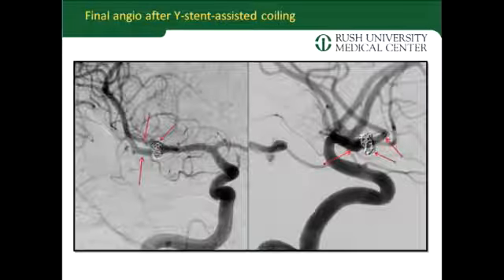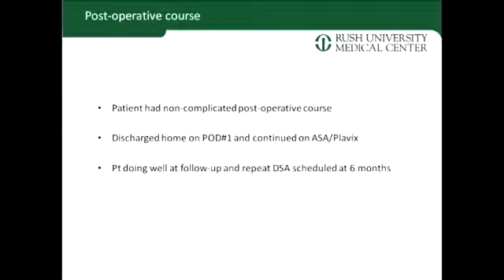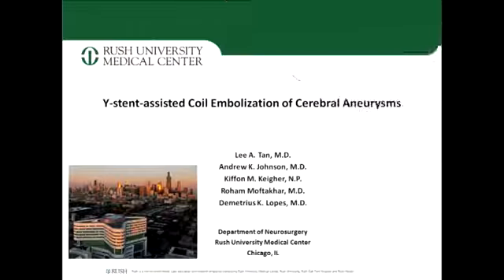This patient did very well through the procedure. She had no change in her neurologic exam. She was discharged the next day and had a successful recovery from this. We feel that this construct has made a tremendous difference in our practice, and I recommend the use of Y stenting whenever we find that the reconstruction of the bifurcation is challenging. And this is just the beginning of an area that has tremendous potential to grow as new devices become available. I hope this is helpful on this topic, and thank you.